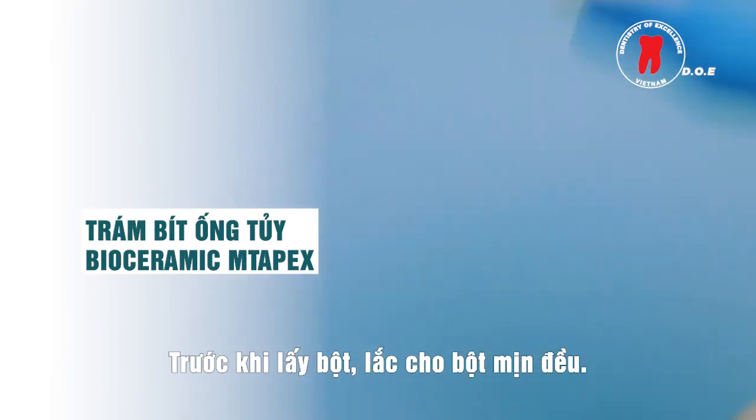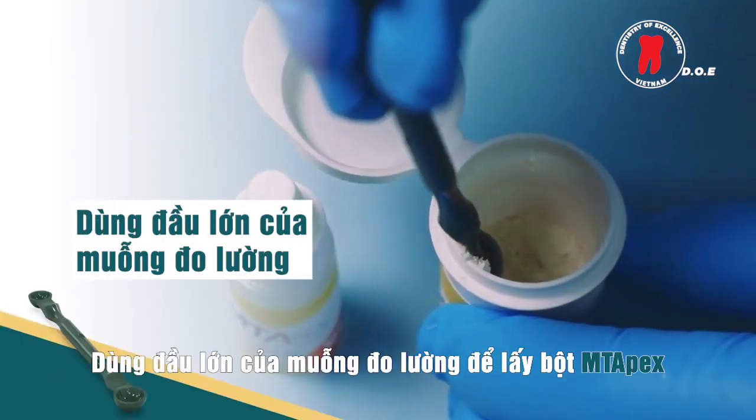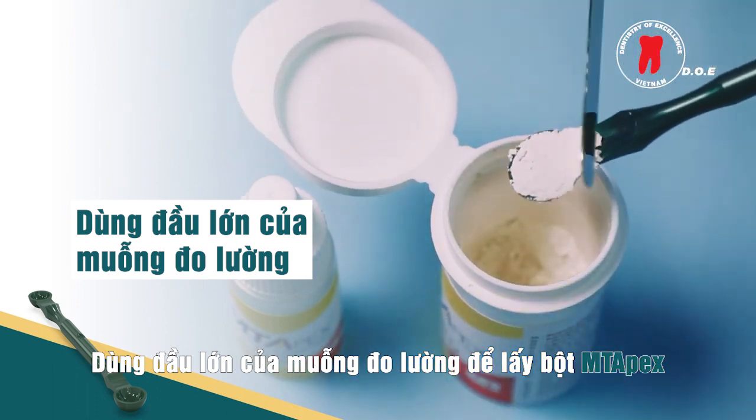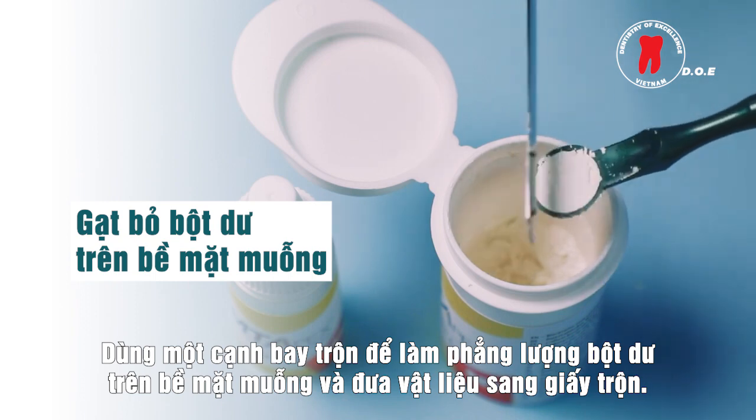To dispense the powder, shake the bottle to fluff the powder. Use the large end of the measuring spoon to scoop up the MTApex powder. Use a spatula edge to level the powder and deliver to a mixing surface.